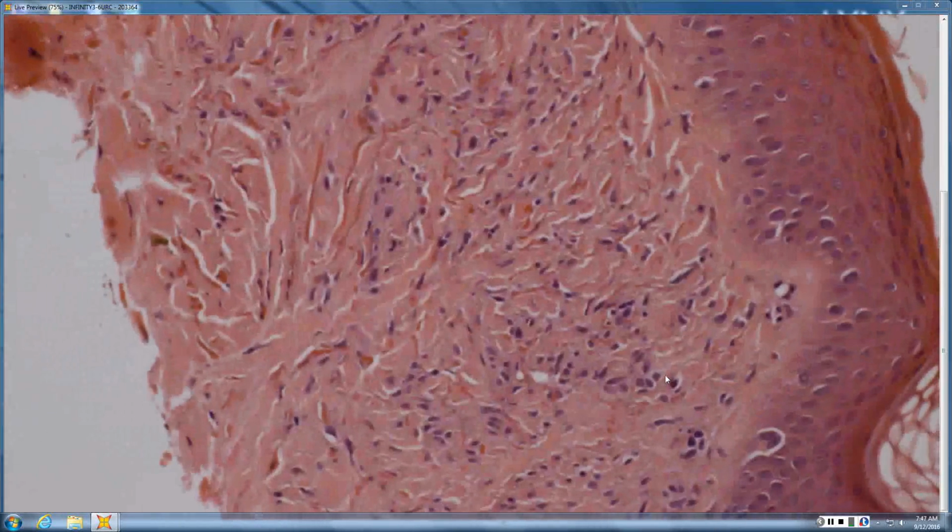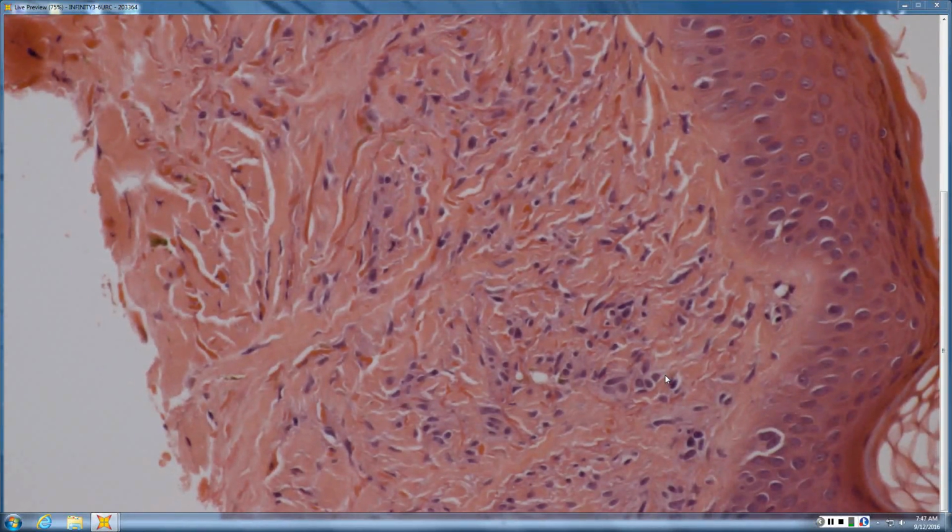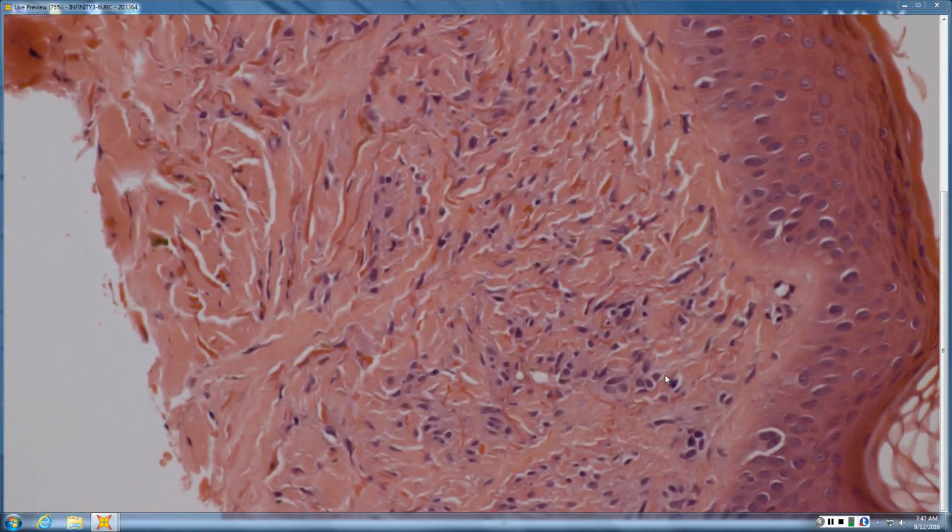So, worried, not worried, what would you do next? And of course, you don't see the base, right? Not seeing the base is a limitation, and most melanocytic lesions that we get in the lab are shaved. So you don't see the sides, you don't see the base. Yeah, so I think I would probably stain this myself, like HMB, to look for the gradient, look at MIB. Yeah, and those things certainly wouldn't be wrong.